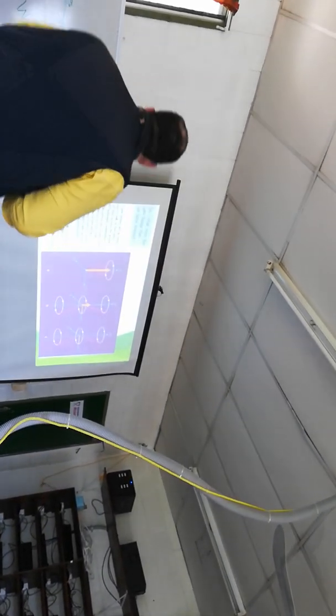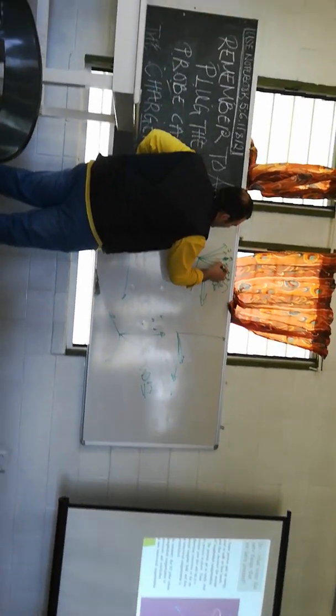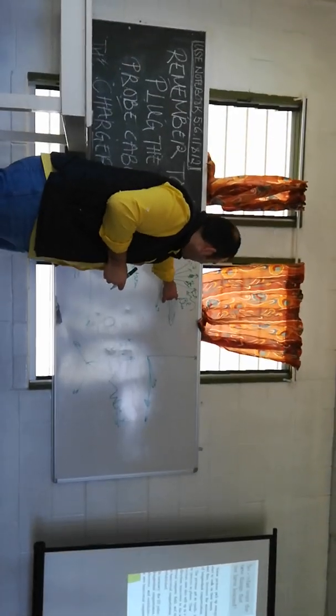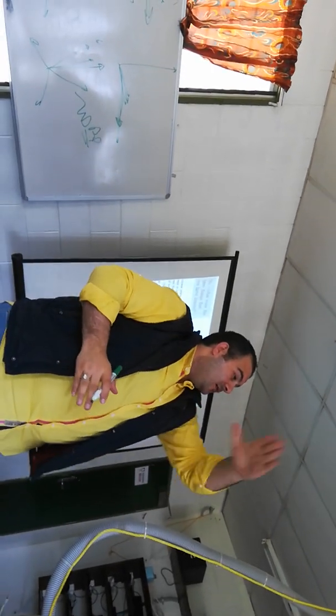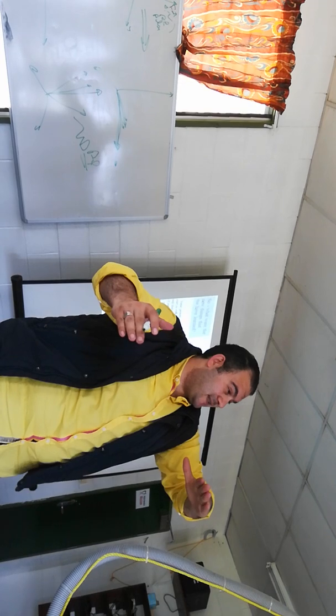So, if we assume that we have two protons, one of them is fat and another one is water, okay? Because fat has hydrogen atoms and water has hydrogen atoms. After a certain time, after we send the radio frequency pulse, you will find that water takes time to be excited, but fat is quickly excited. Okay, after a long time, all of them will be excited.